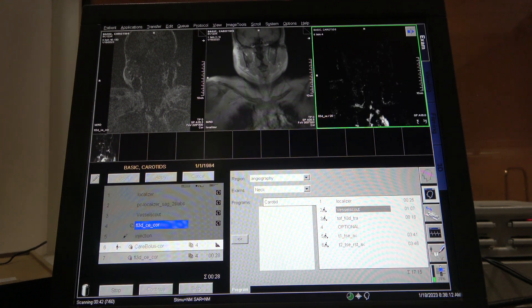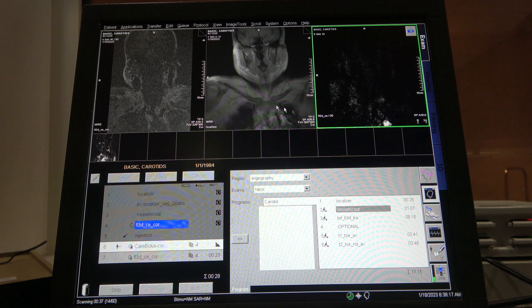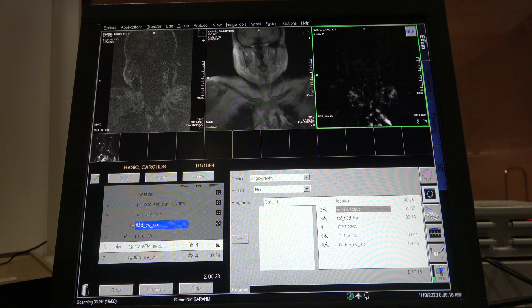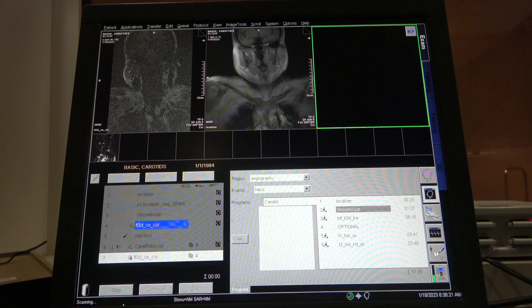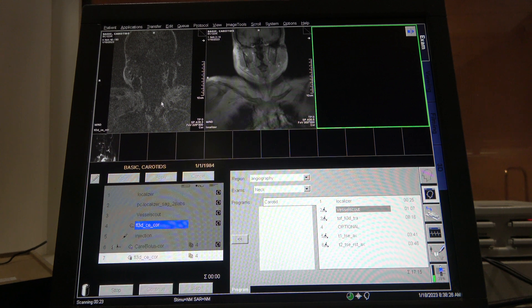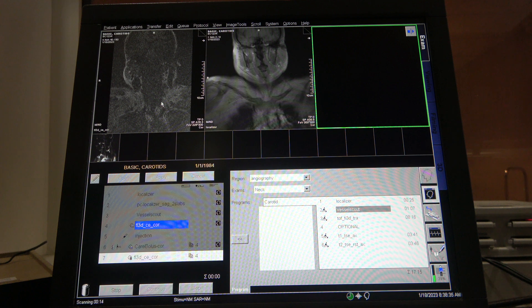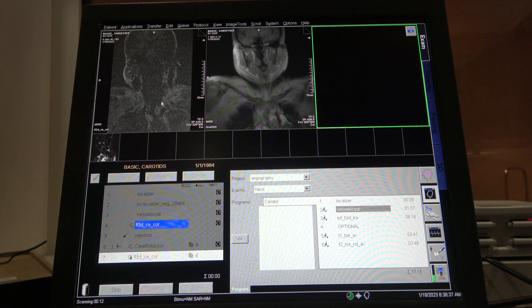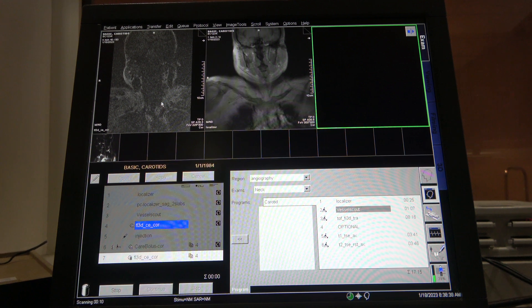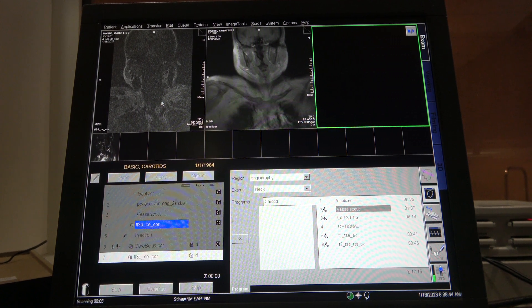Once you see contrast come up, you hit start and it's going to give you the same scan. Later today we might have someone come in with contrast and we'll try it again.